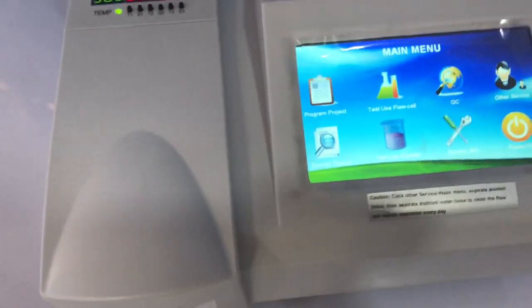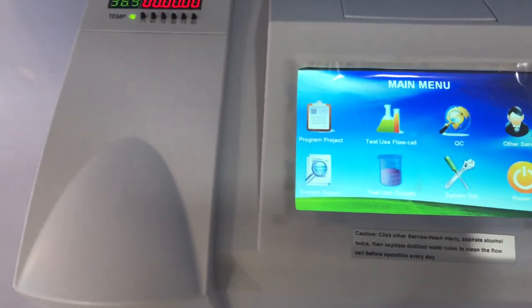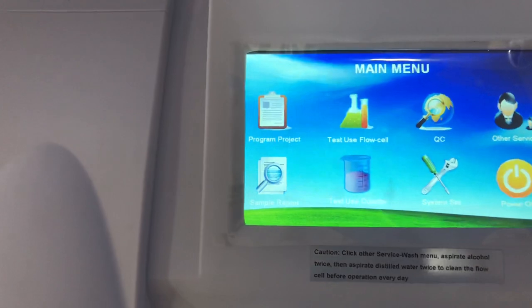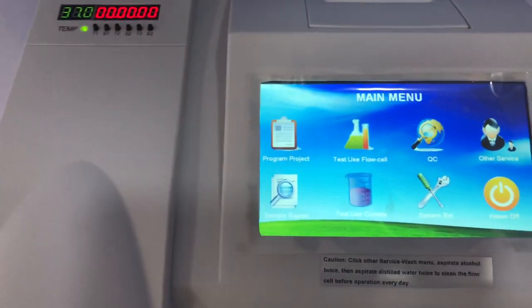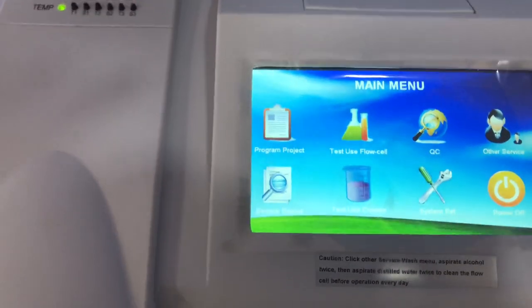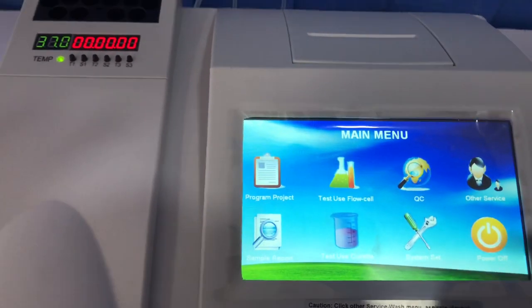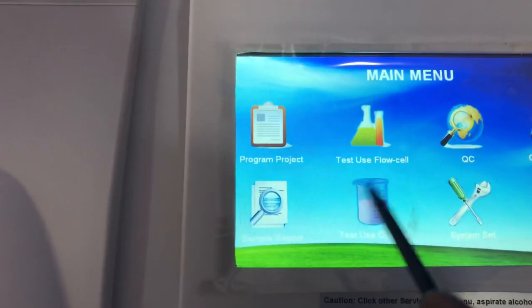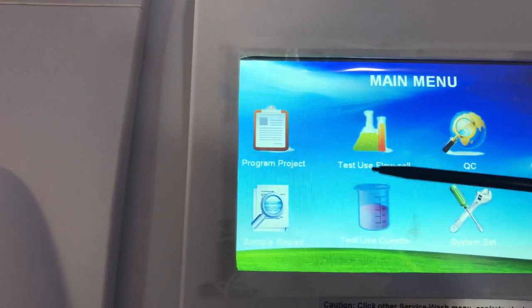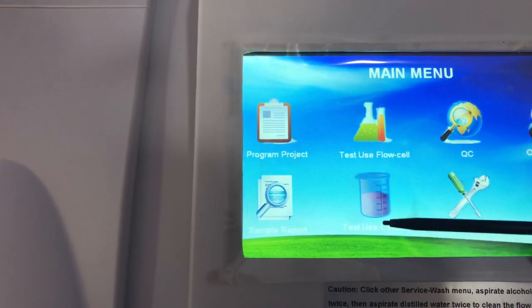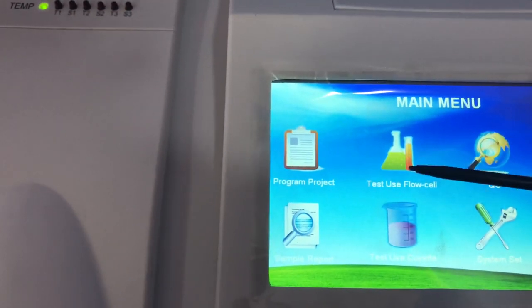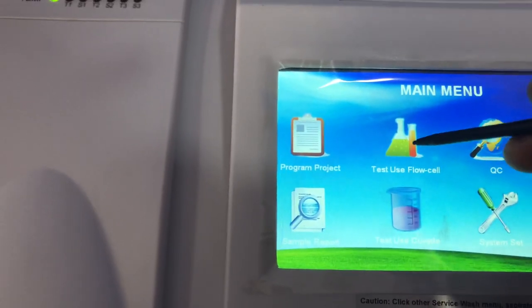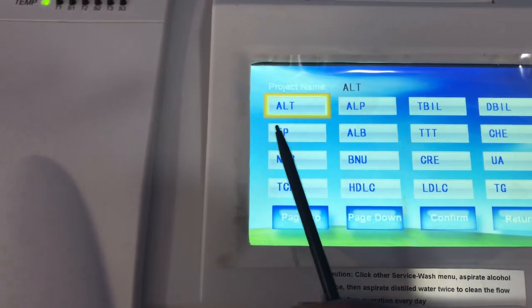Welcome once again. This is part two of the how-to-use-the-semi-auto-chemistry-analyzer series. In part two, we go through how to program the machine for a test. I've shown you the main menu already — this is how the main menu looks, where we can perform a test using the flow cell or the cuvette. In this particular machine, we are going to use the flow cell, so to perform a test you click on the flow cell.